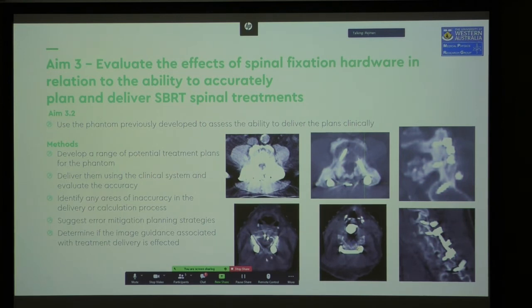So as it kind of shows you in the slide before, 4 millimeters allows us to get the dose from kind of 50% to 100%, or maybe a 40 or 50% drop off in dose, which is great, but it means if your patient is positioned 2 millimeters wrong, suddenly the dose is 20+% higher, which has pretty severe side effects. So we know the dose needs to be within about 5% of what it should be to get the clinical effects we are after. So 20% overdoses to the spinal cord can be pretty serious. So we need to make sure that we can align these patients properly.